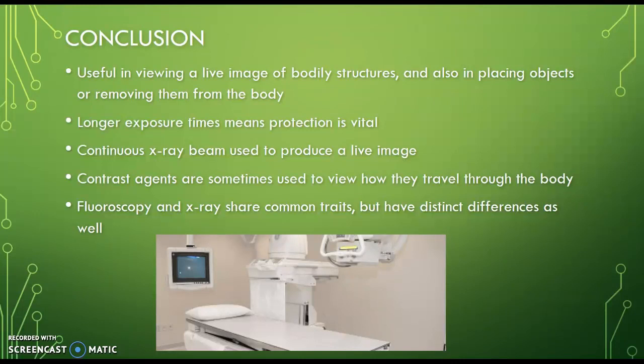In conclusion, fluoroscopy is useful in viewing live images of bodily structures and functions, and also in placing objects or removing them from the body, such as with the orthopedic extremity nailing that I went over previously. Fluoroscopy uses longer exposure times, which means protection is vital in order to ensure that you are safe as well as coworkers and patients.